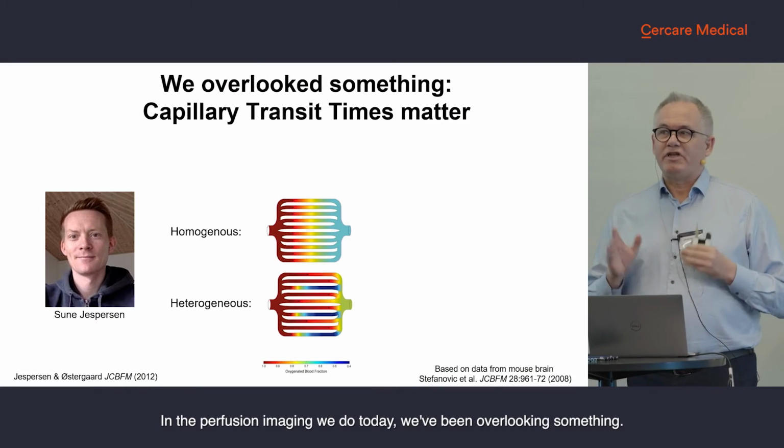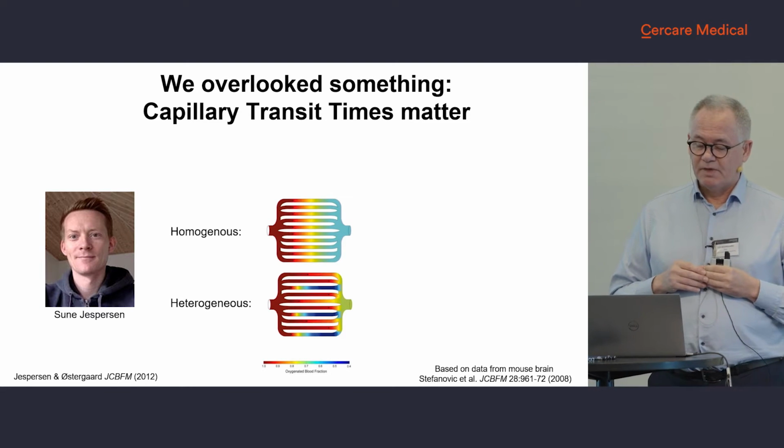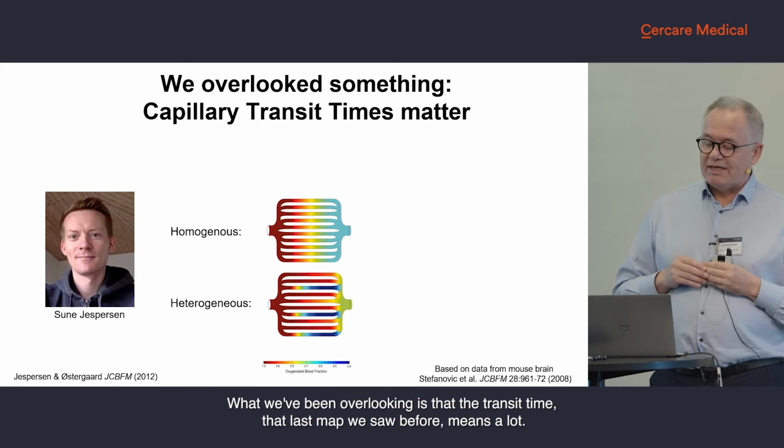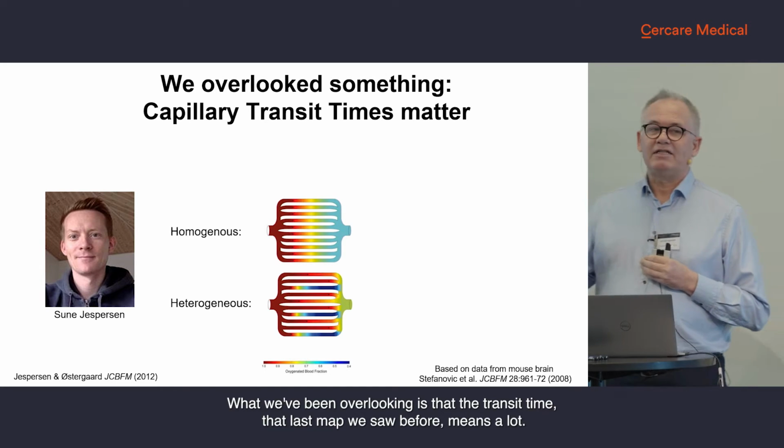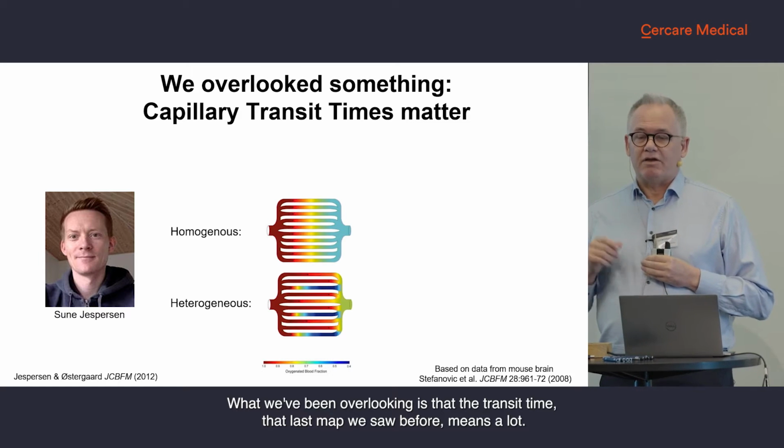In the perfusion imaging we do today, we've been overlooking something. What we've been overlooking is that the transit time, that last map you saw before, means a lot.